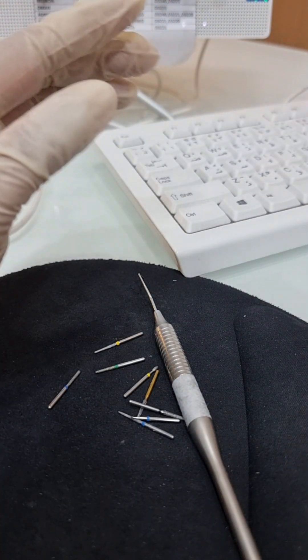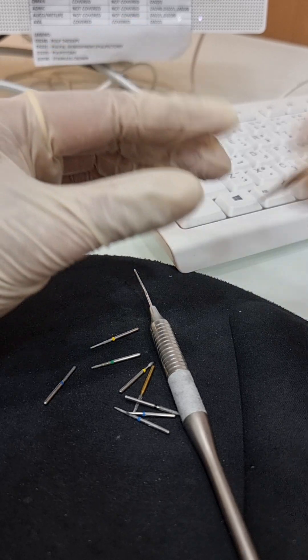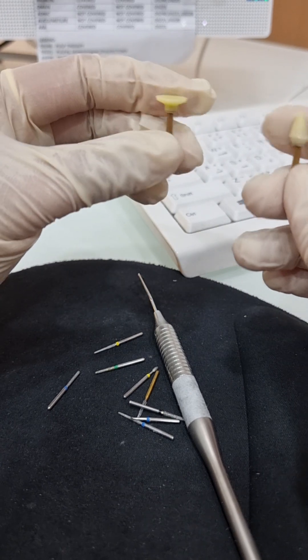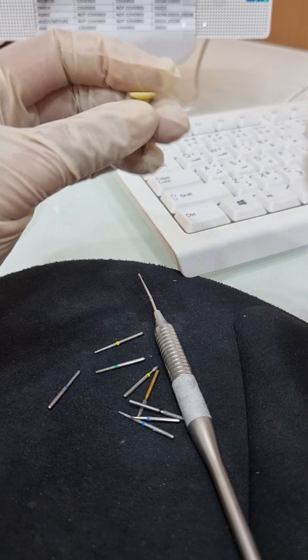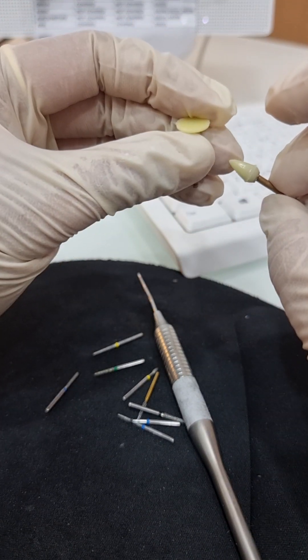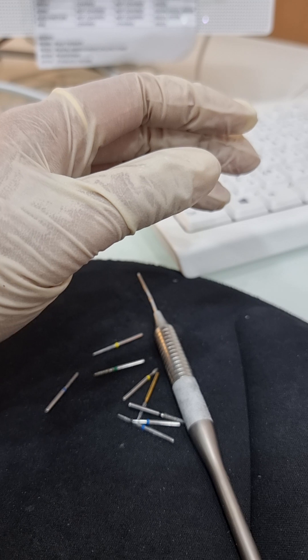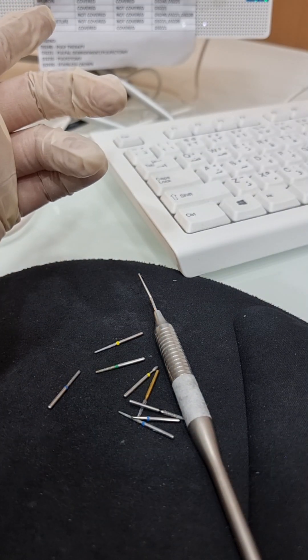For composite polishing, you'll have flex discs and enhanced points - these are expensive and wear out fast. When you buy them they often come in packs of 20, but you really only need four or five. If you have your own clinic with materials at your disposal, great - but if you're buying specifically to practice, just get sufficient quantity, not extra. After your exam you'll have to find people to buy the leftovers, otherwise it's a waste, especially since many people don't use enhanced points regularly in daily practice.